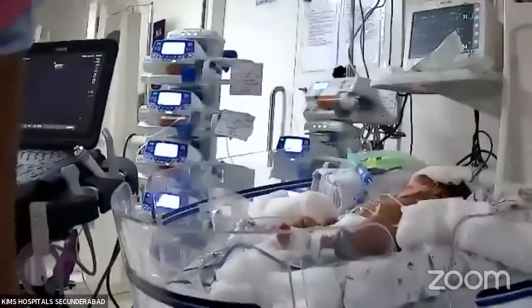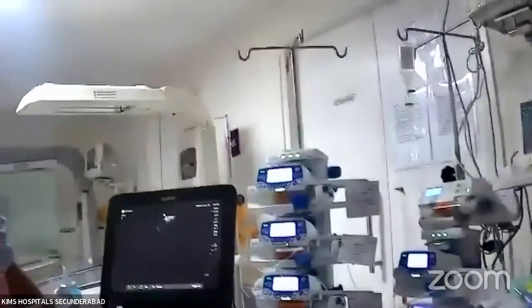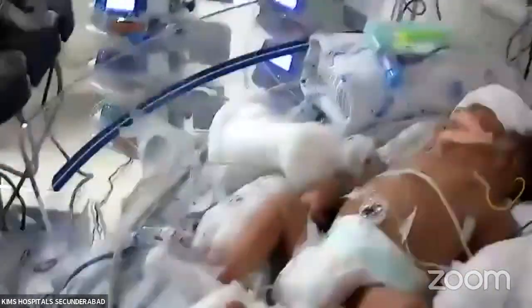Again, we are live. So now, sorry for the interruption. Now we are in continuation with what we saw in the PowerPoint presentation. That is just a small synopsis. Now this is the patient. You can see one of the patients lying in the bed. A ventilated patient is the best patient to learn on because they won't move. If some move also, you can give some sedation and do it.